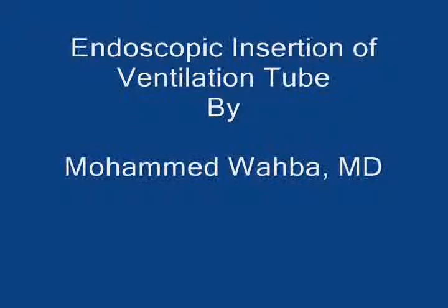In this clip, I'm going to demonstrate the endoscopic insertion of a ventilation tube for the treatment of persistent otitis media with effusion not responding to medical treatment.